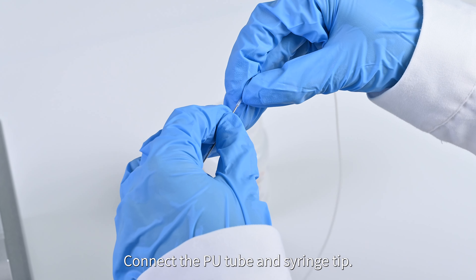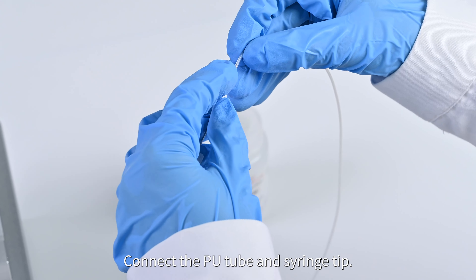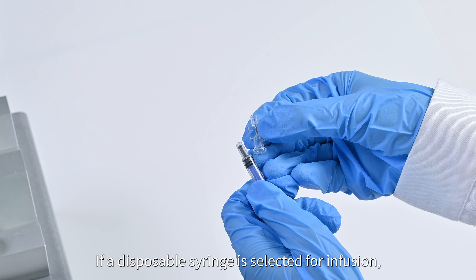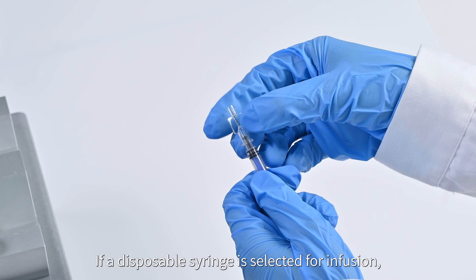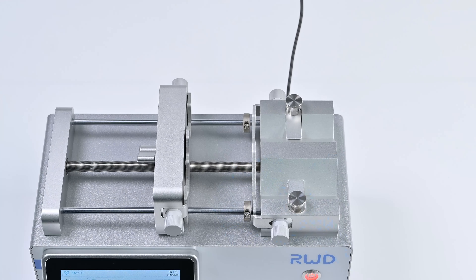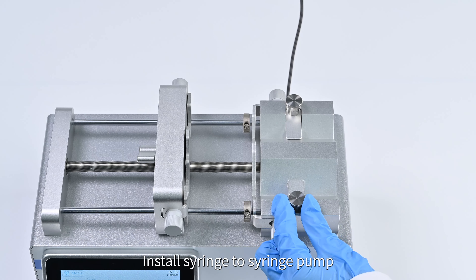Connect the PU tube and syringe tip. If a disposable syringe is selected for infusion, attach the adapter to the disposable syringe before connecting the PU tube. Then install the syringe to the syringe pump as shown in the video.